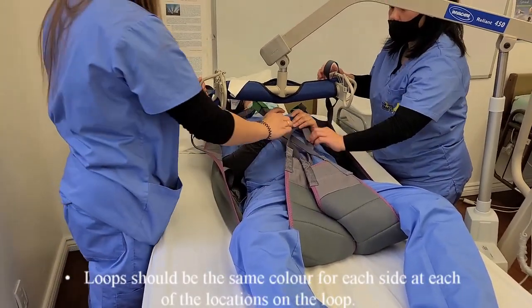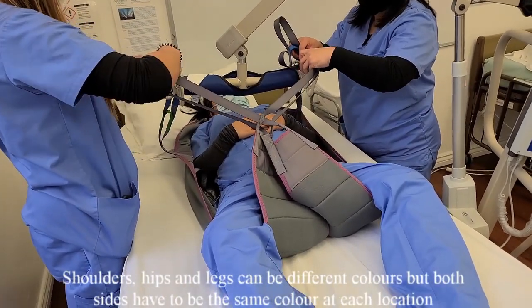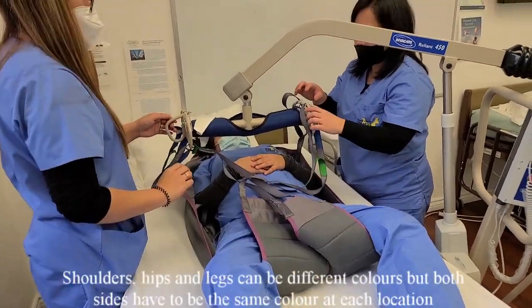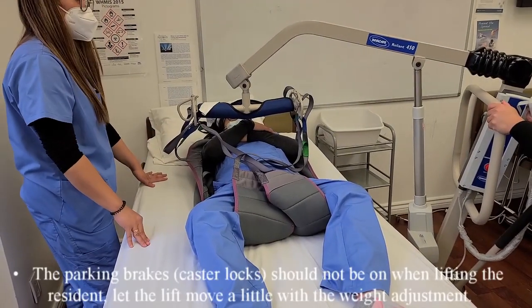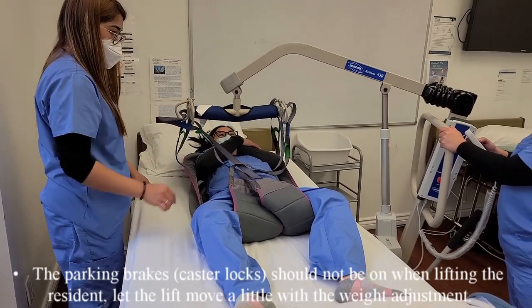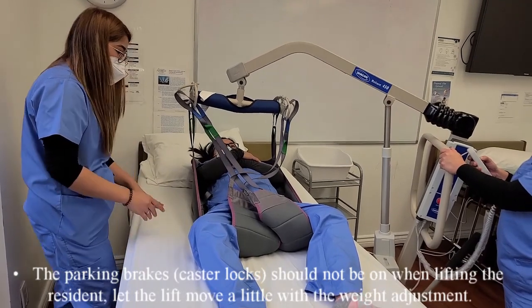Loops should be the same color for each side at each of the locations on the loop. Shoulders, hips, and legs can be different colors, but both sides have to be the same color at each location. The parking brakes, caster locks, should not be on when lifting the resident. Let the lift move a little with the weight adjustment.